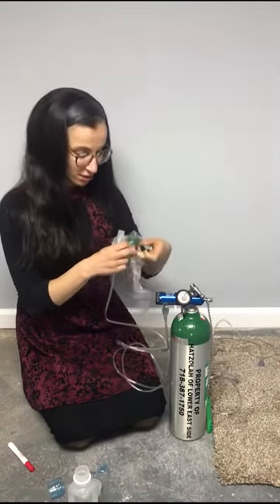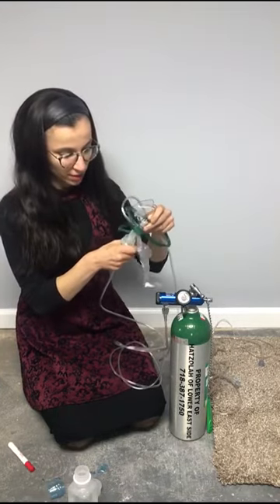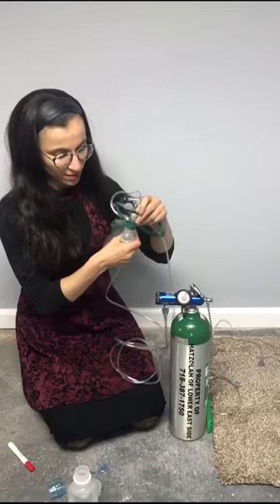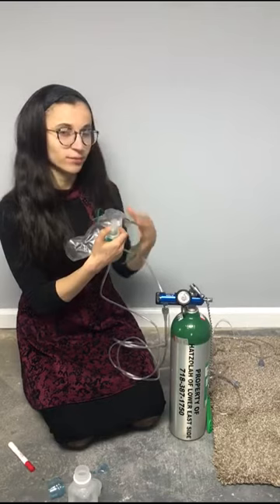So let's say this was not a non-rebreather. You would have a simple face mask. This would go straight on here. So pretend the bag wasn't there, it goes straight on. You turn on the oxygen, it will mist, and it will go right in.